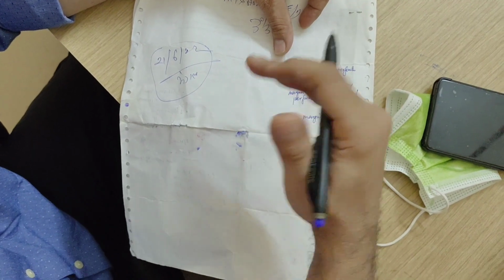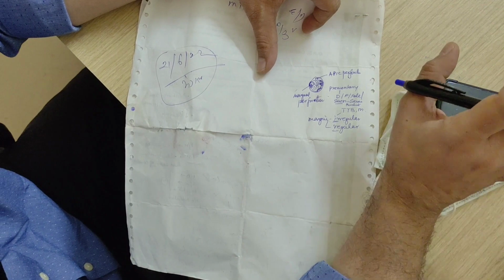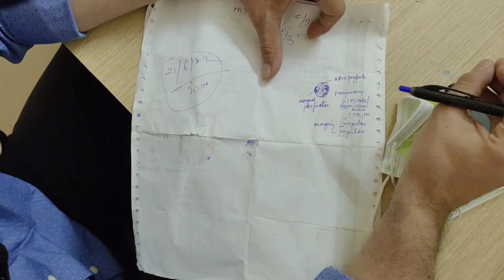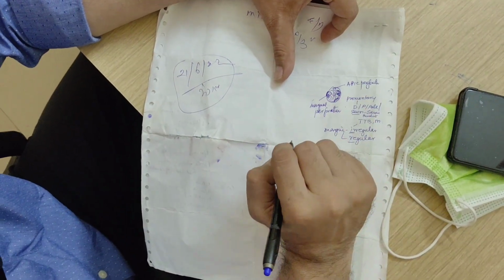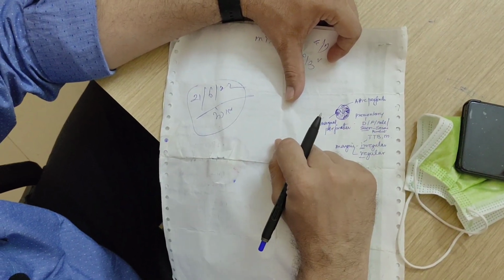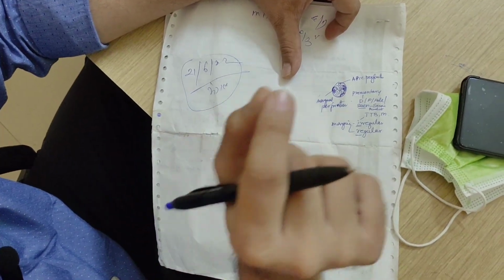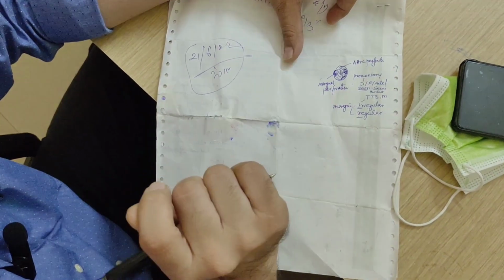Okay, so there is a gentle bulge. You have to tell that the promontory mucosa appears to be edematous, and there are polypoidal changes on the promontory mucosa. You can have a small polyp coming out through the perforation of the middle ear because of the promontory mucosa being more edematous. If there is a polyp coming out, then you have to probe the polyp to understand from where the polyp is coming out, but you never pull the polyp.